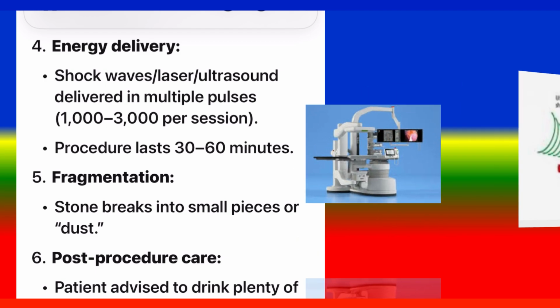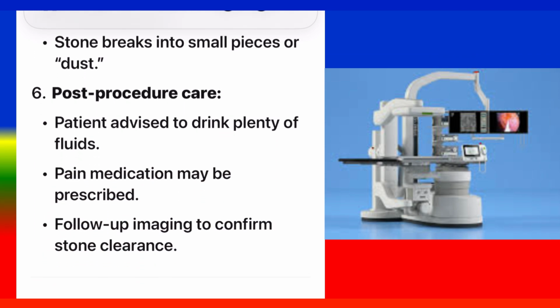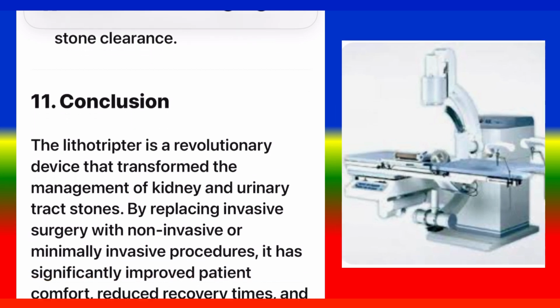5. Fragmentation. Stone breaks into small pieces or dust. 6. Post-procedure care. Patient advised to drink plenty of fluids. Pain medication may be prescribed. Follow-up imaging to confirm stone clearance.